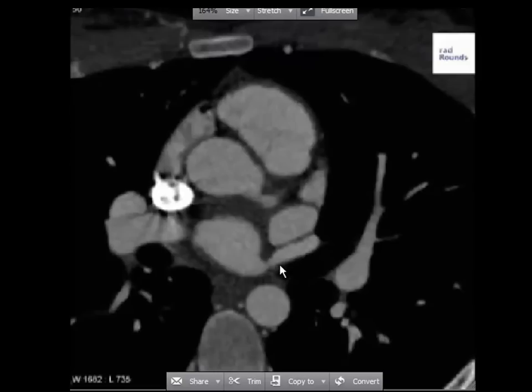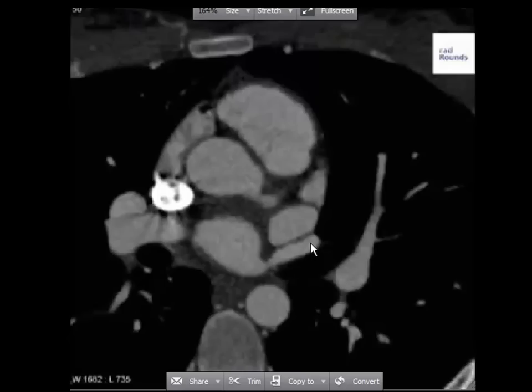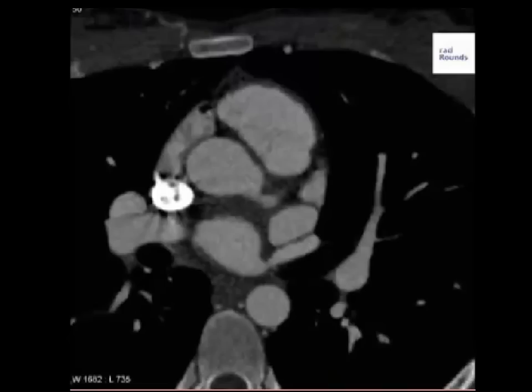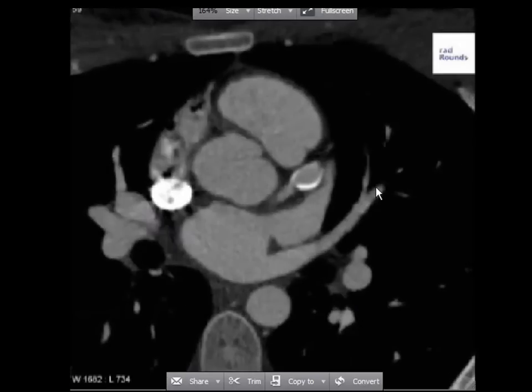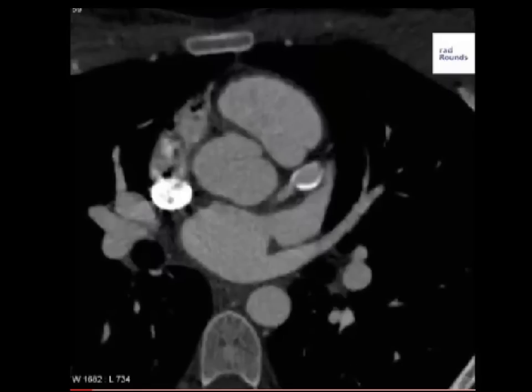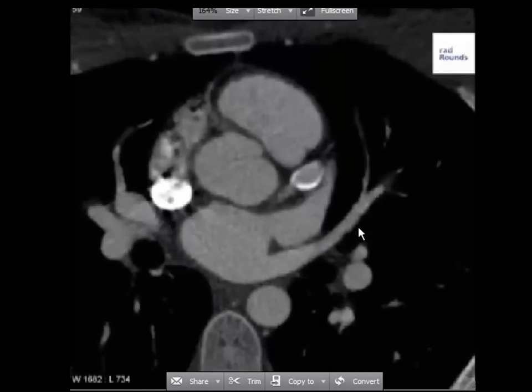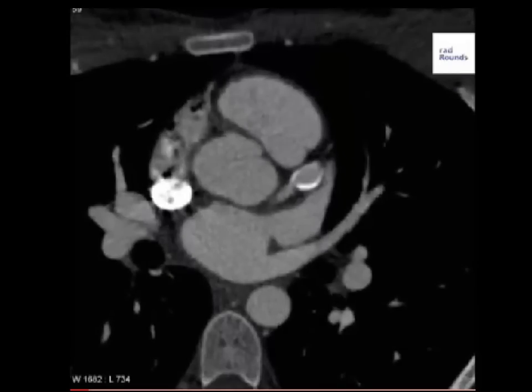This vessel is opening into the left atrium — the posterior-most part of the heart, close to the vertebra. So this blood vessel is a pulmonary vein. There are four pulmonary veins that open into the left atrium: two from the right side and two from the left side. This is one of the two on the left side of the patient, and it is opening here. So this is a pulmonary vein opening into the left atrium.